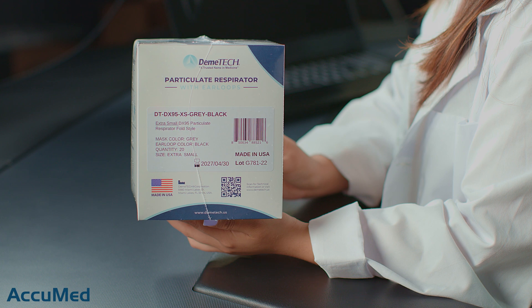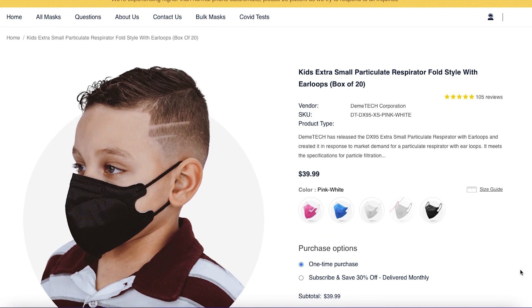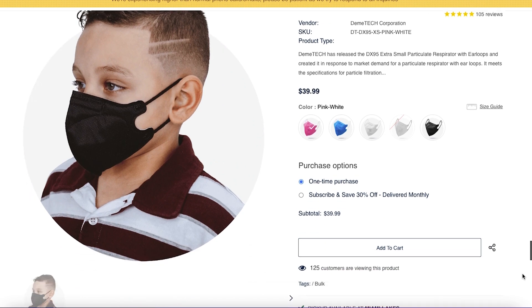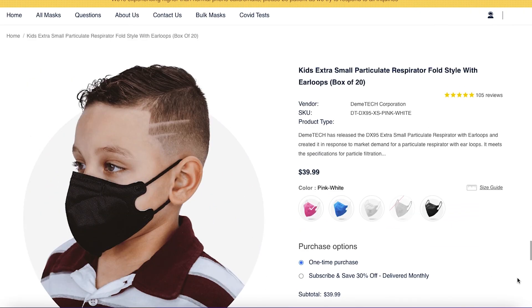Hello everyone and welcome back to the Accumet channel. Today we're reviewing the Demitech model DT-DX95XS, which is an extra small. These are made in the US and we purchased them from the manufacturer's website. These are the Kit's extra small fold-style ear loop mask. They come in a box of 20 for $39.99 and also have a 5 out of 5 rating with 105 reviews.